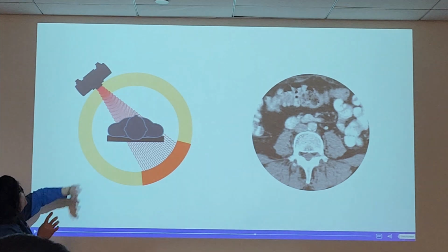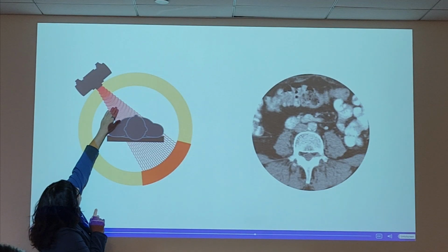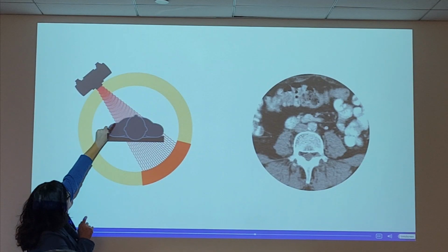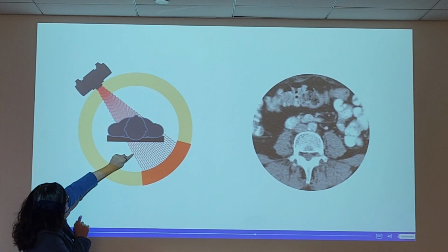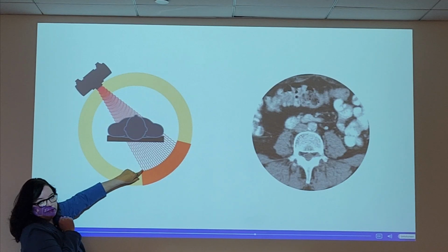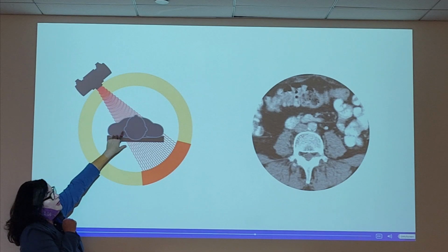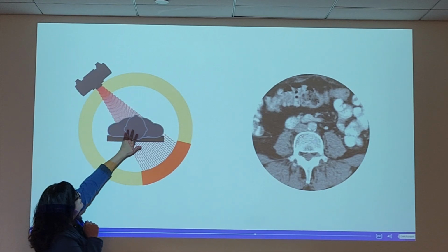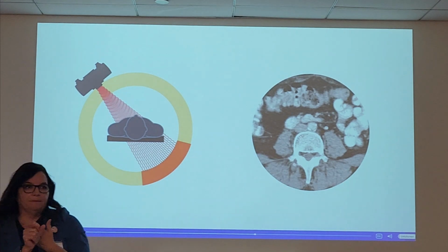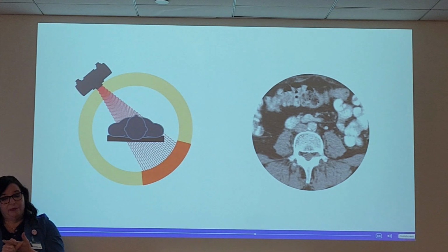Yeah. We have the X-ray source. We have the X-ray beam. We can see the frequency. So if we counted how many crests we have here versus how many crests we have here, we know that there is an energy difference. And it happened because the patient was in the way. Attenuation of an X-ray beam is either being absorbed by the body or it's being scattered by the body.